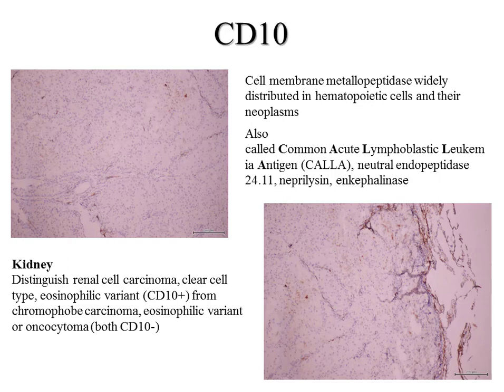In our case, CD10 was negative, so the final diagnosis was chromophobe carcinoma or metastasis of the chromophobe carcinoma of the kidney into the lung.